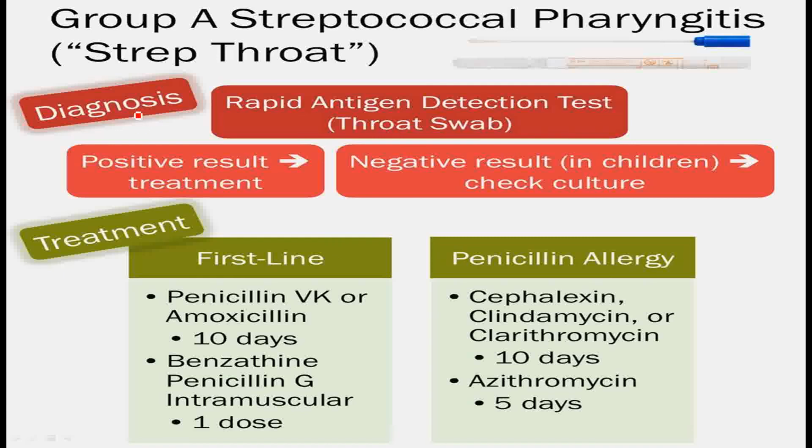After diagnosis, if the result comes positive, then treatment is done. Negative results in children, check culture. If it comes negative, then check culture. If it comes positive, then the positive test goes to treatment. And if it comes negative, then again check the culture.